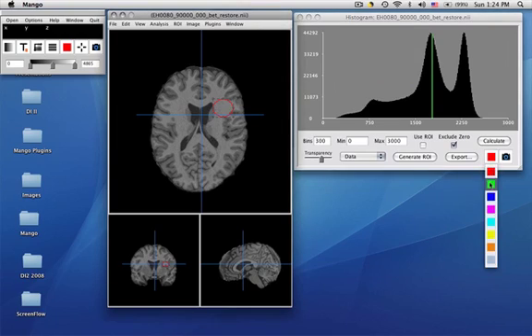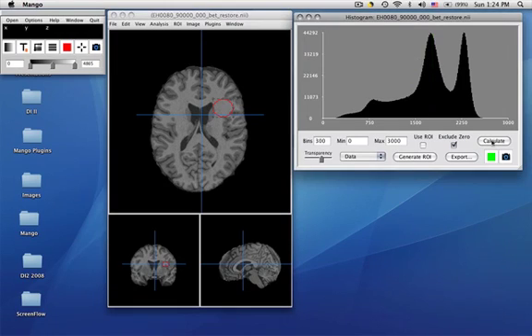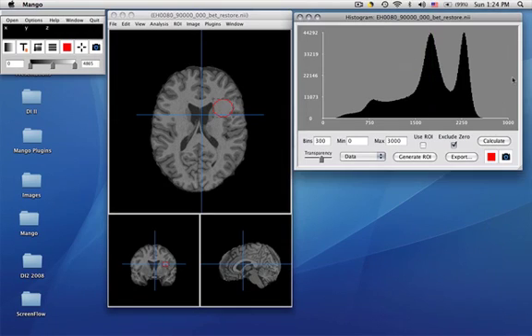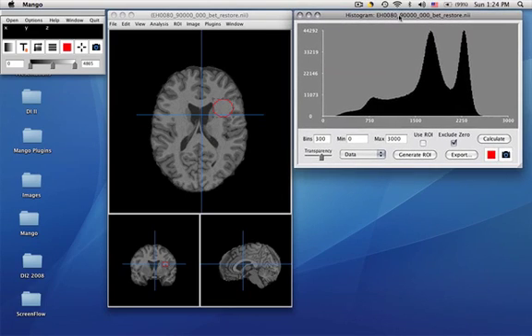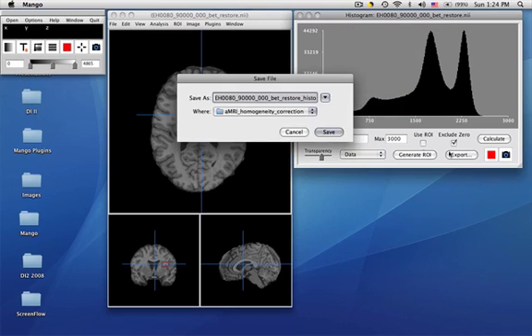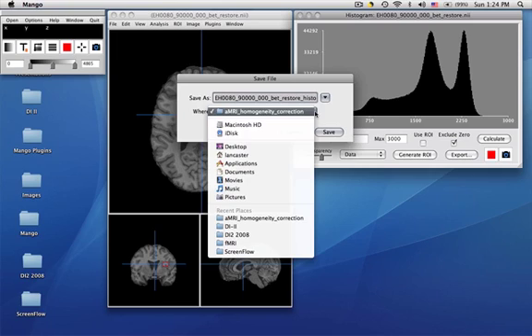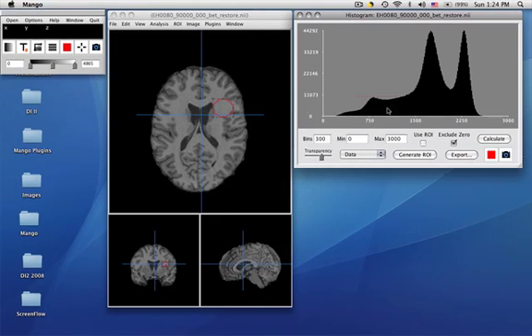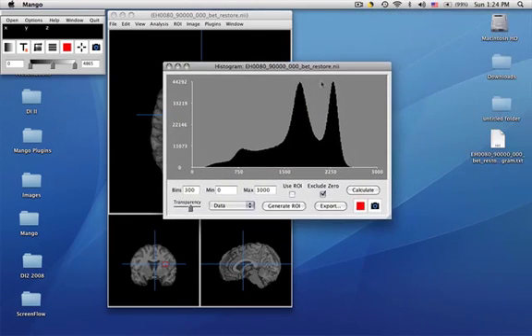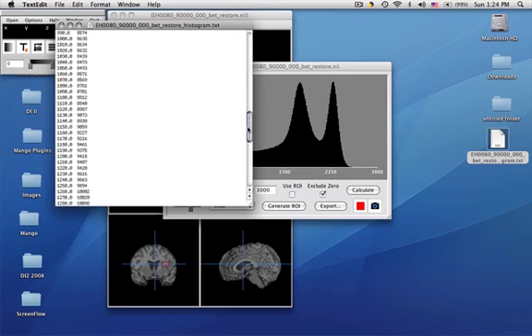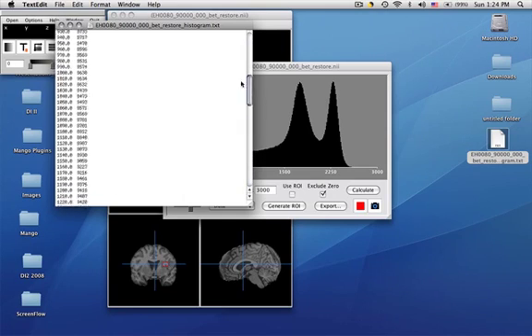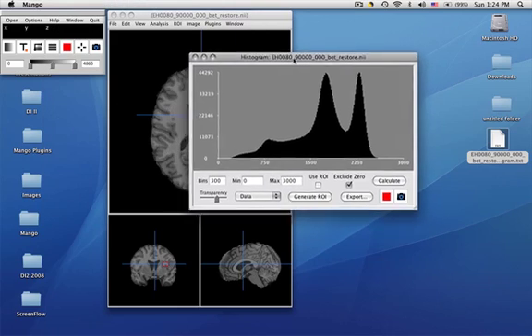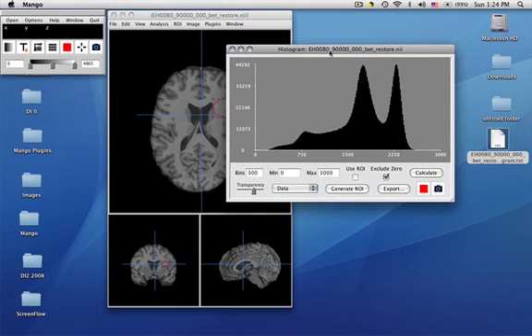Oops, I forgot to clear this ROI off. And I like the red pointer. So there's a couple things you can do with the histogram. If you'd like to do analysis that's not provided here, we can export the histogram and you can send it to the desktop if you'd like. And we'll do that. And if we look over here, now there's a text file. That's that histogram. There's a bin number on the left and the number of voxels at those values on the right. And this can be loaded directly into Excel for further analysis.